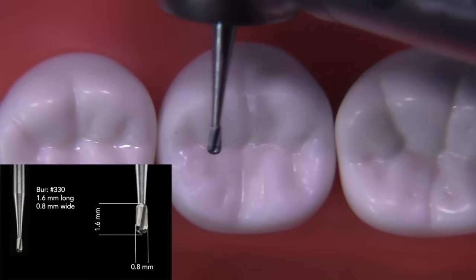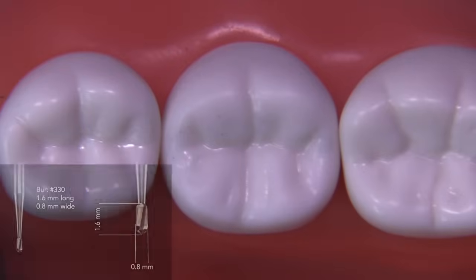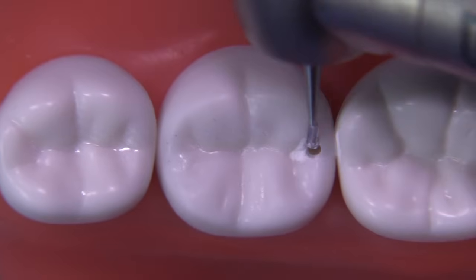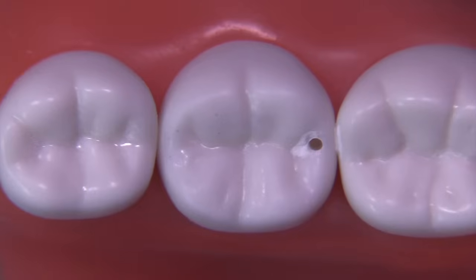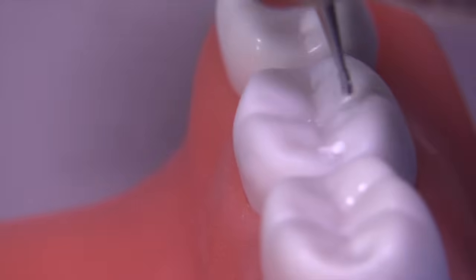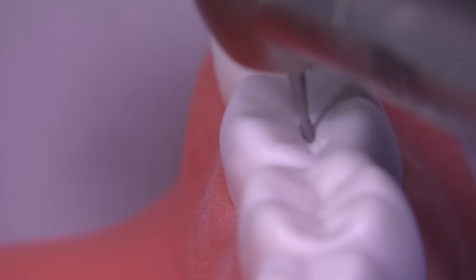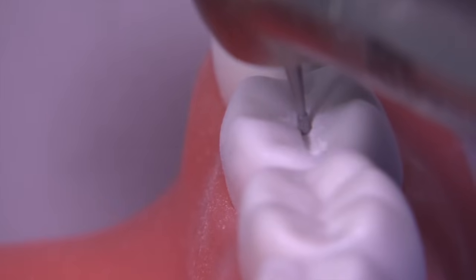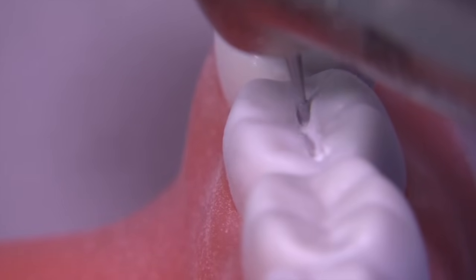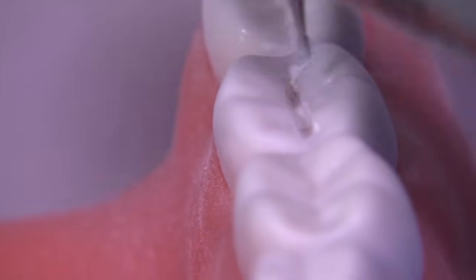The 330 burr is really the go-to burr for starting class 1s, class 2s, and class 3s. We are going to start this preparation on the mesial, since it's an MO, and place the burr about at the height of the marginal ridge and go down 1.5. Keep the burr perpendicular to the occlusal table — the occlusal table being defined as an imaginary plane that would lay on top of the cusps of this tooth. Because this tooth tips lingually following the curve of Wilson, we are going to have to make a conscious effort to keep the burr tipped slightly lingually as well.